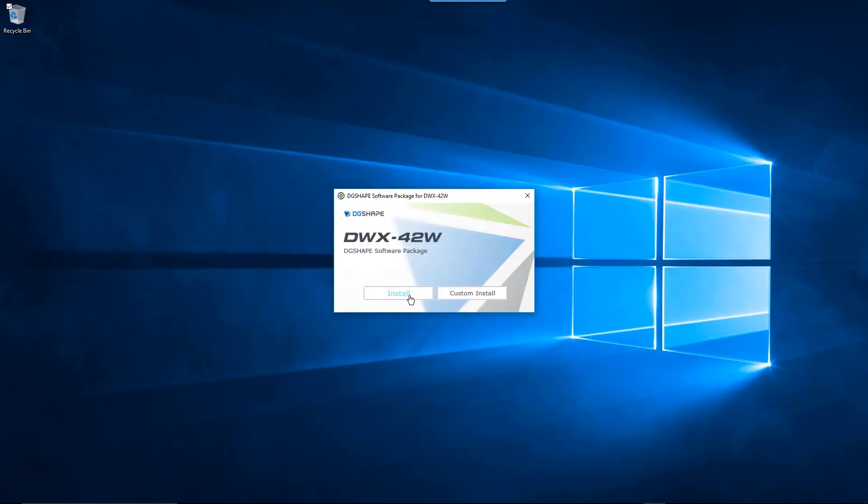When the DGShape software package window is displayed, click the Install button. Click OK to begin the installation process.